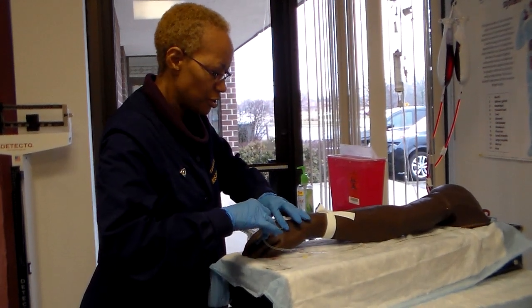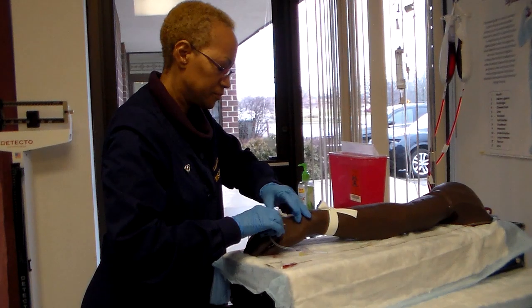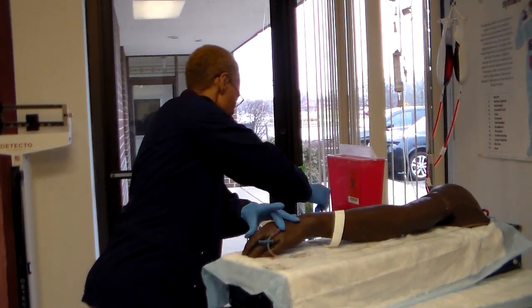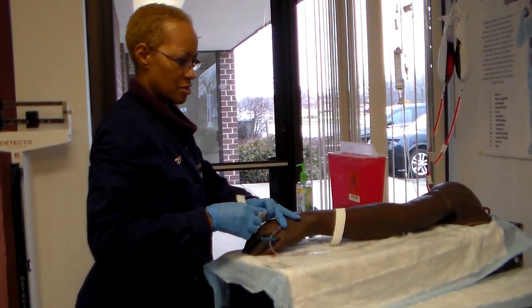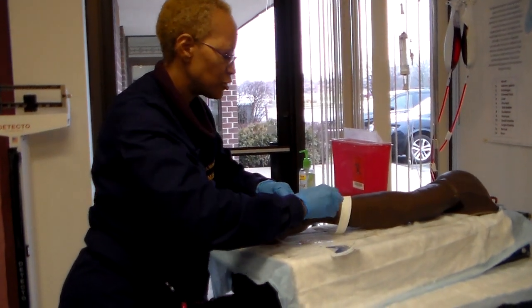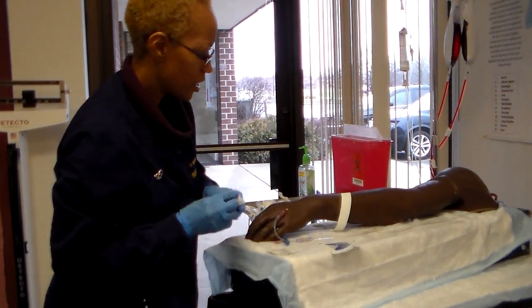You're going to secure the hub of your catheter, and you're going to connect your IV tubing. And release your tourniquet. I didn't do too bad. I didn't get too much all over. Okay. And open up my IV tubing, and hopefully I get a nice flow. Okay, good.